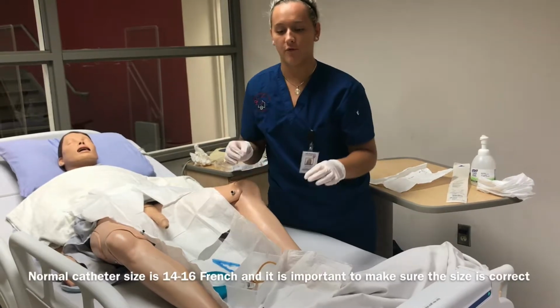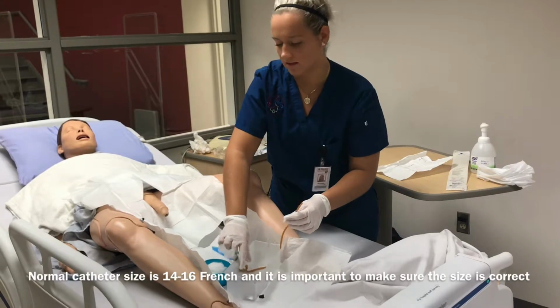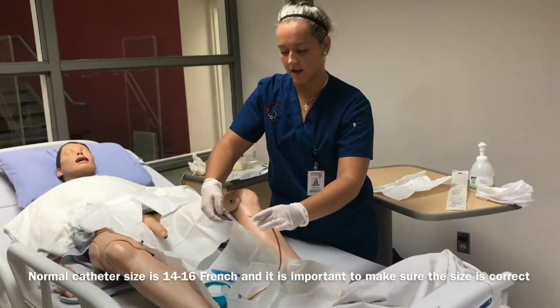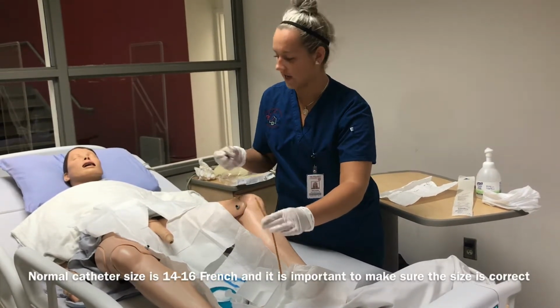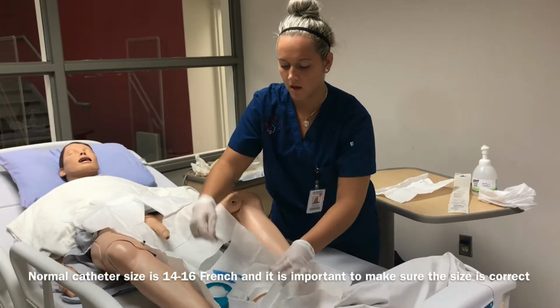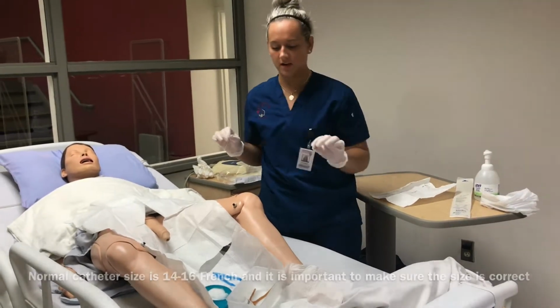And then to prepare for the catheterization, I'm not going to do it right now as this is just a mannequin, but you would open the loop and then insert about 3 inches of the catheter into the loop, lubricating it so then it can easily slide into the urethra. And then once you're done with that, you would just dispose of it.